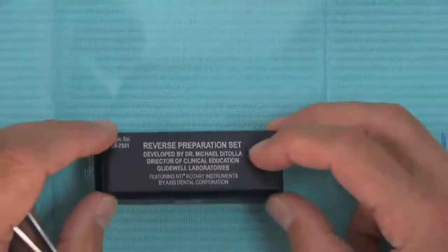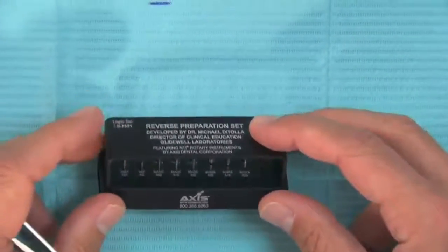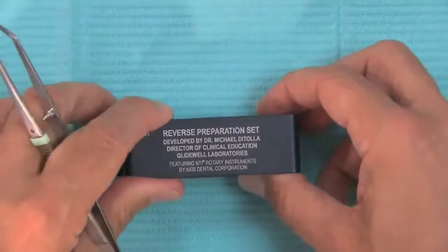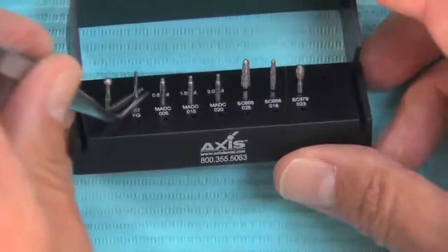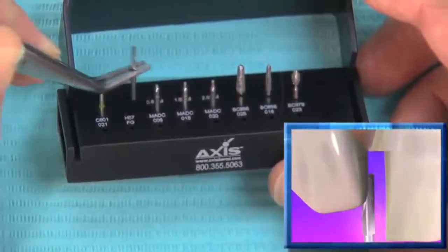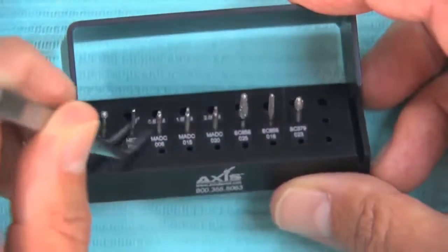Let's take a closer look at the burrs on the reverse preparation burr kit. Here is the reverse preparation burr kit from Axis Dental. Axis makes it, puts it together, and it's sold through all dental dealers. It's called a logic set — LS 7551 — but I think everybody knows it as the reverse preparation kit. The first burr is a 56 carbide burr — you could use a 57 as well — and this is used to break the contacts in the first step. It's critical that we get a retraction cord in place, a small one without any medication on it, very early in the sequence.